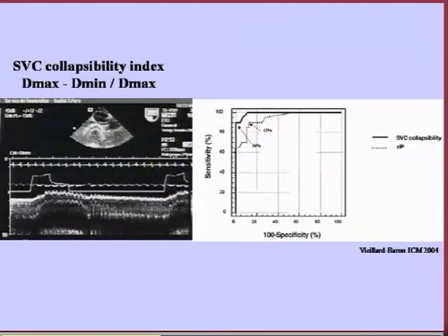But it's more interesting to see how the heart is moving and what happened regarding some vessels such as the superior vena cava. And as you know, we described the superior vena cava collapsibility index to predict the response to fluids. It's a good parameter. Look at this example. It's a very nice example because the expiratory time is very long.